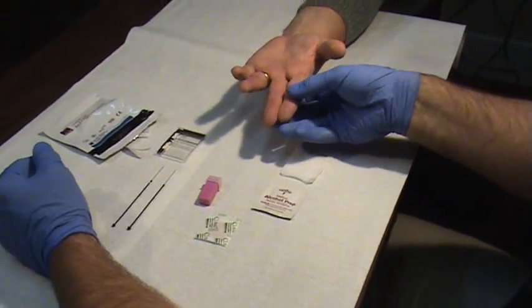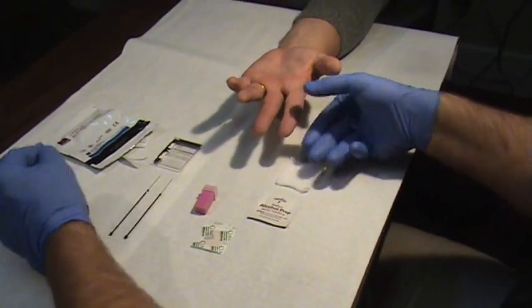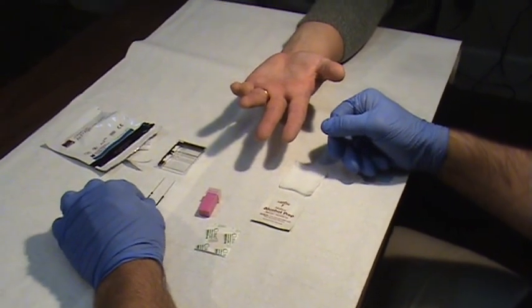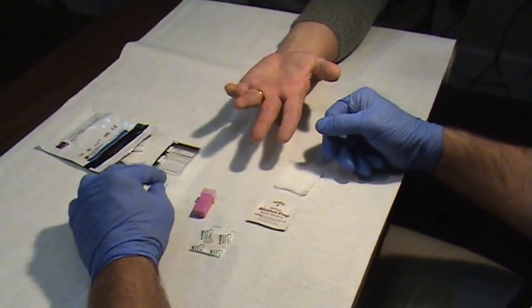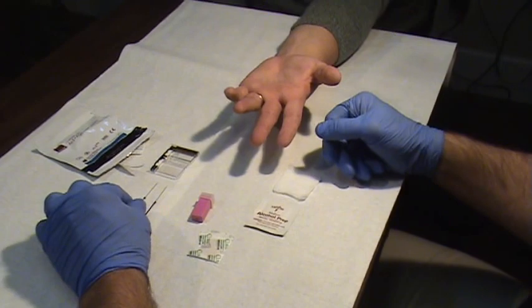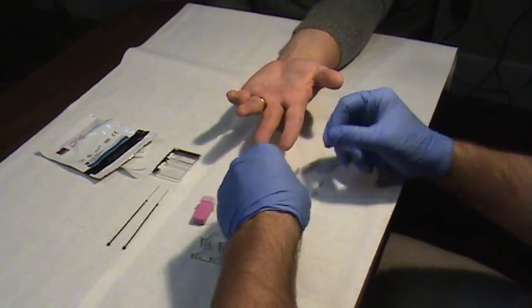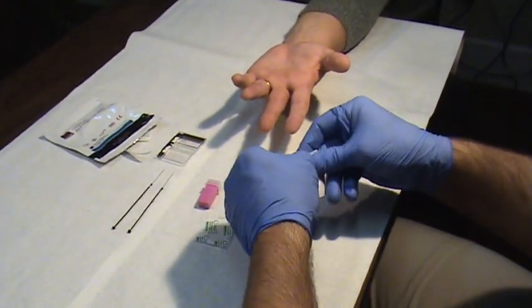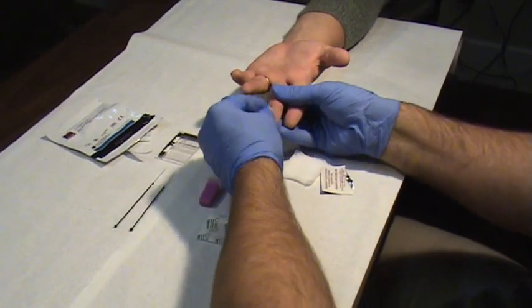And I see that one's ready. So what I do is I always prep two lancets in case you get an air bubble. I'm going to try and create an air bubble so you can see what we do in that case. So I'm going to take the alcohol pad. I want to clean the area thoroughly.